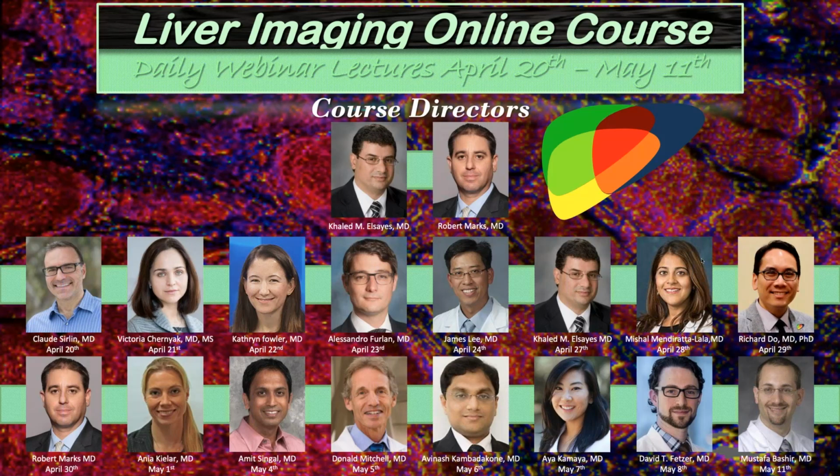I wanted to comment on the first question. Forgive me, I don't remember her name, but there was a radiologist who wondered about the possibility of tumor in vein in the right hepatic vein. I agree with Dr. Mitchell's response that in this particular case, you have one single image in the portal venous phase or delayed phase where it looks like there might be a tumor in vein.